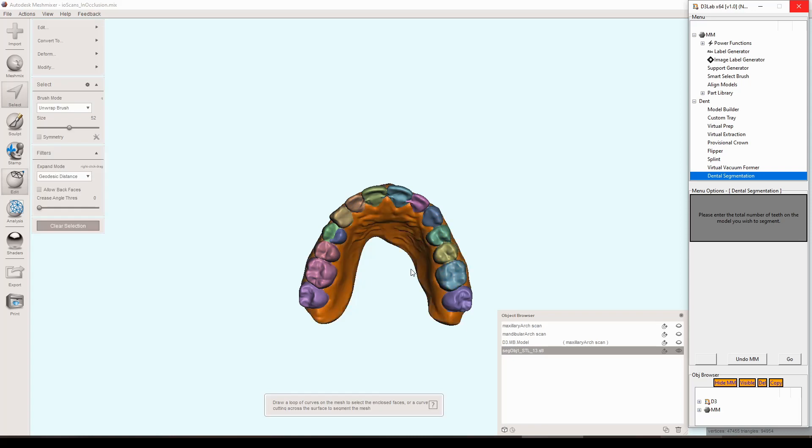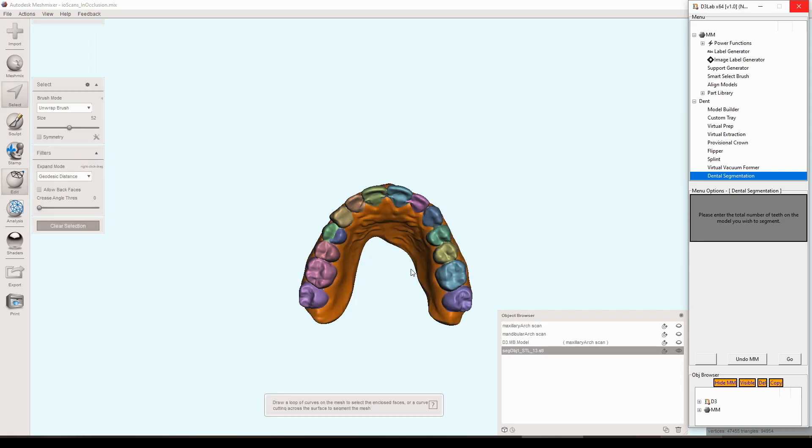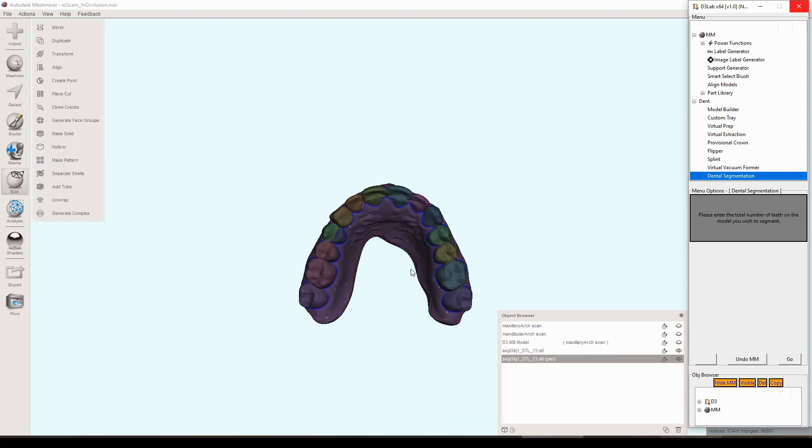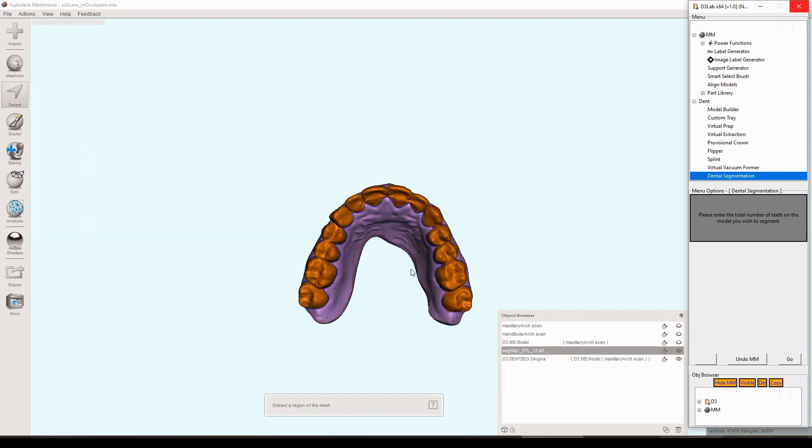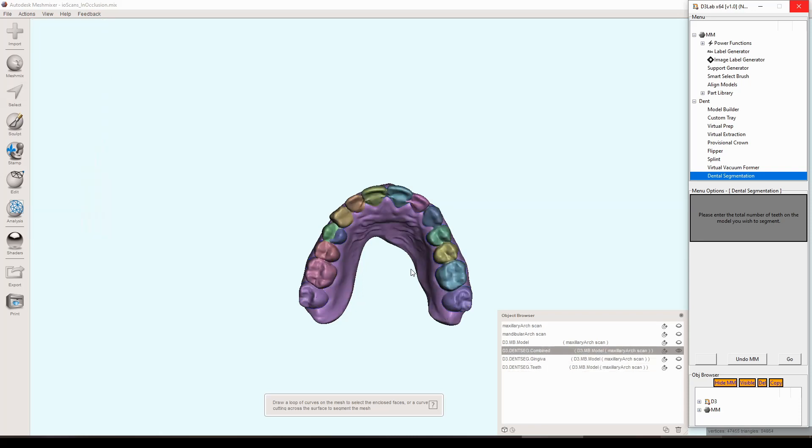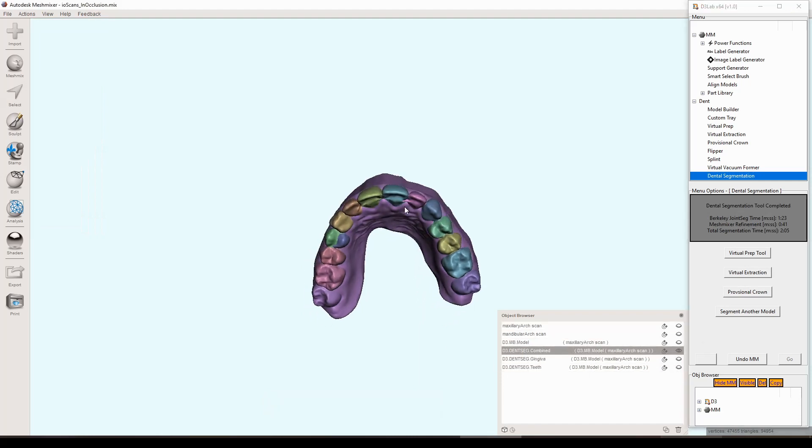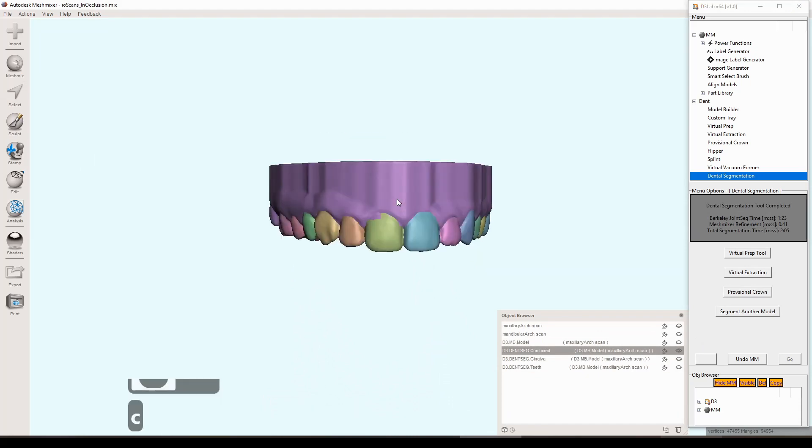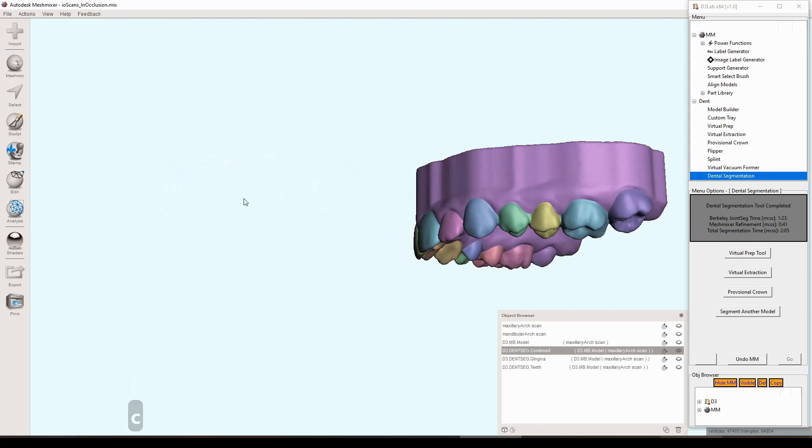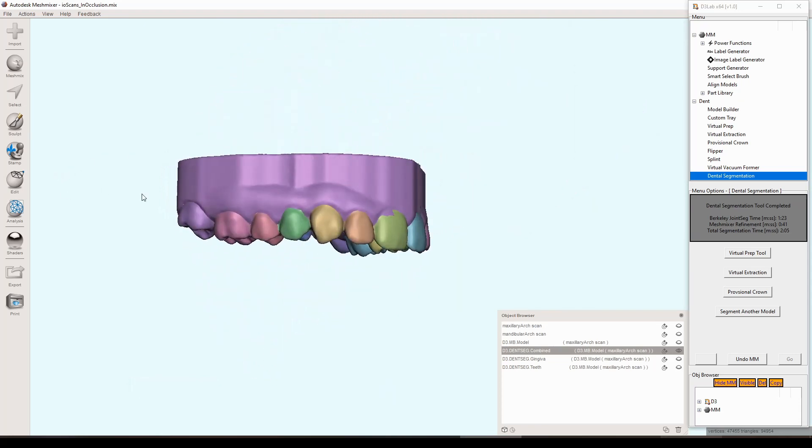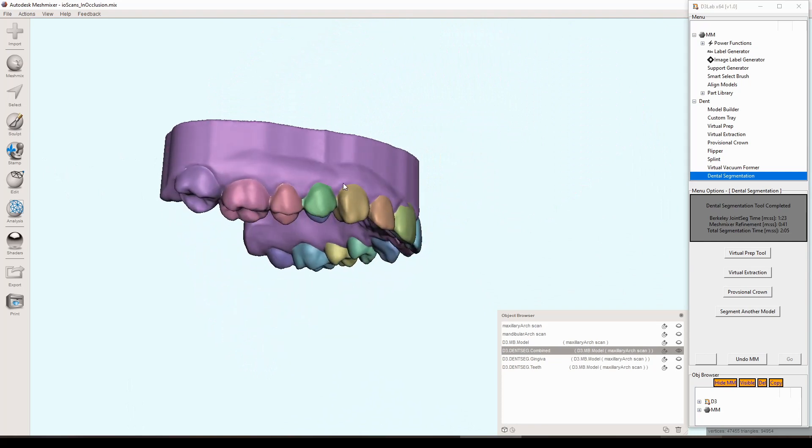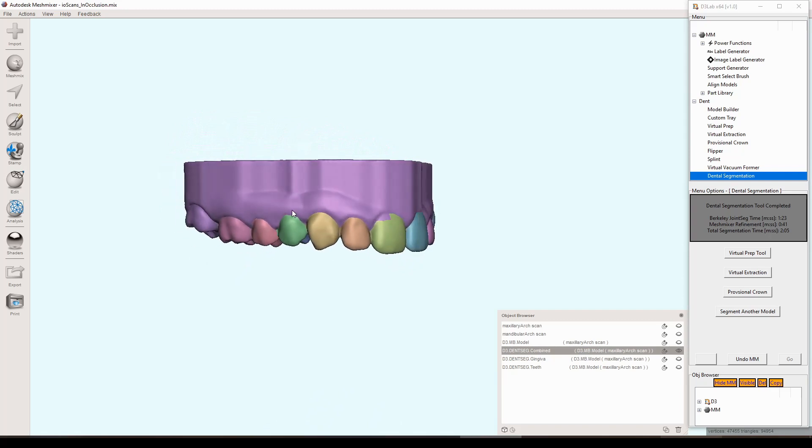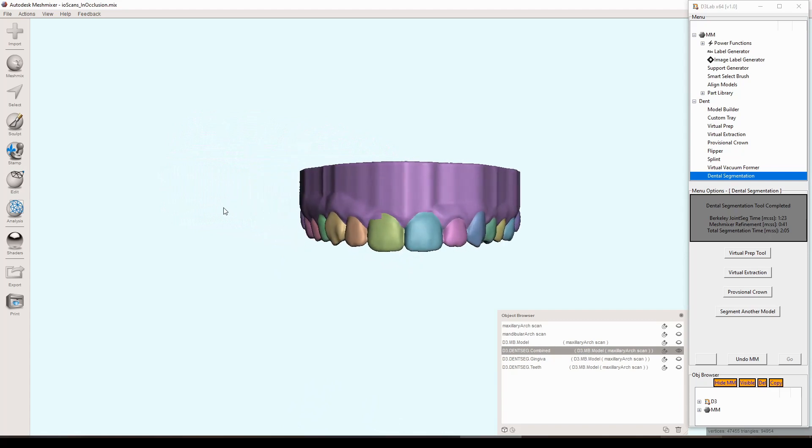Then it goes through and takes a look at each segment, and if it's over a certain threshold in size it will consider it gingiva or model base and then combine those. Everything else is considered to be teeth. As I said in the very first video, there may be multiple segments within each tooth and there might need to be a little bit of correction. Sometimes the gingiva is not perfect, so I'll show you right now how to go through and correct some of those inaccuracies like this one right here. That will probably happen in a lot of cases, so this is how to do some of the basic corrections.